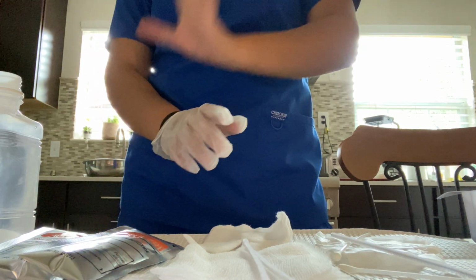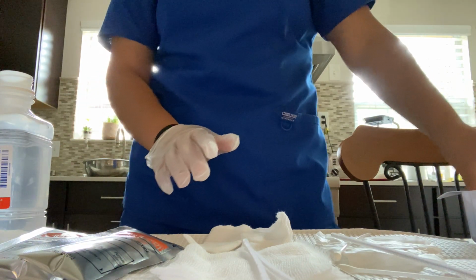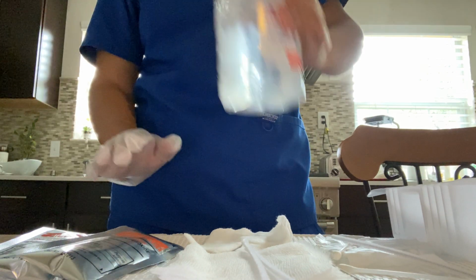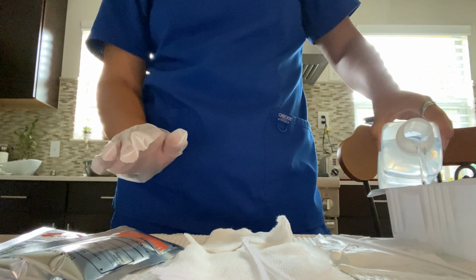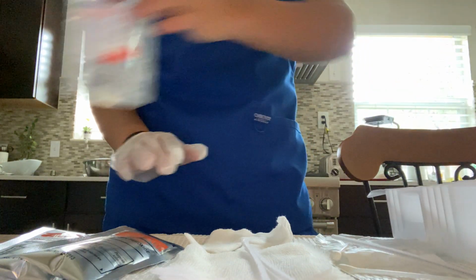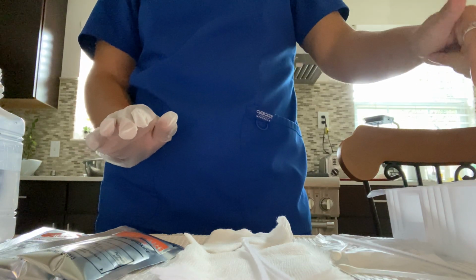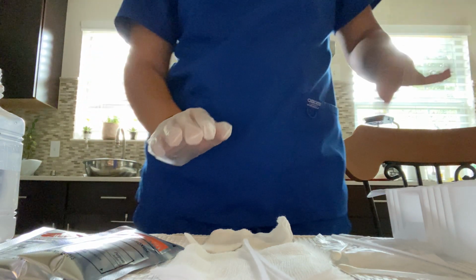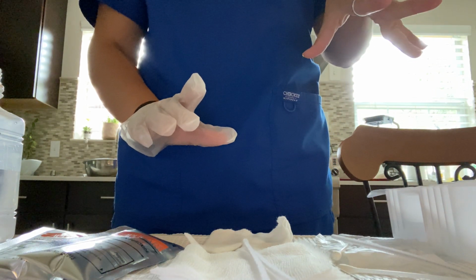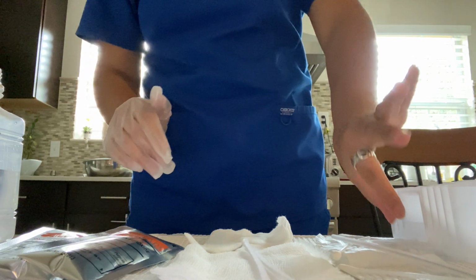I'm going to use my dirty hand to pour my saline into my compartments. So here's our container. We have 3 compartments. One is to put the dirty stuff over there, and two is to clean them. So I've poured it in my compartments. After that, I'm going to put my other sterile glove on.